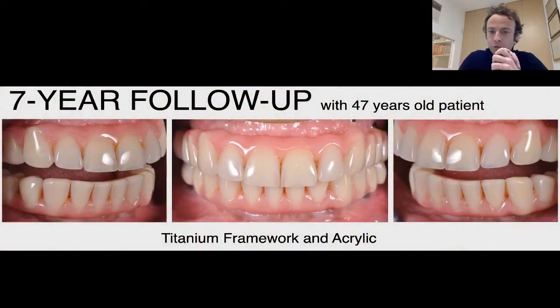And I want to point out with you how, also in the case of a titanium framework or any kind of framework that is then finalized with acrylic or with composite, this kind of solution absolutely cannot be considered completely final. And so this is the reason why, in my opinion, it's important to find a solution that really can be defined as final.